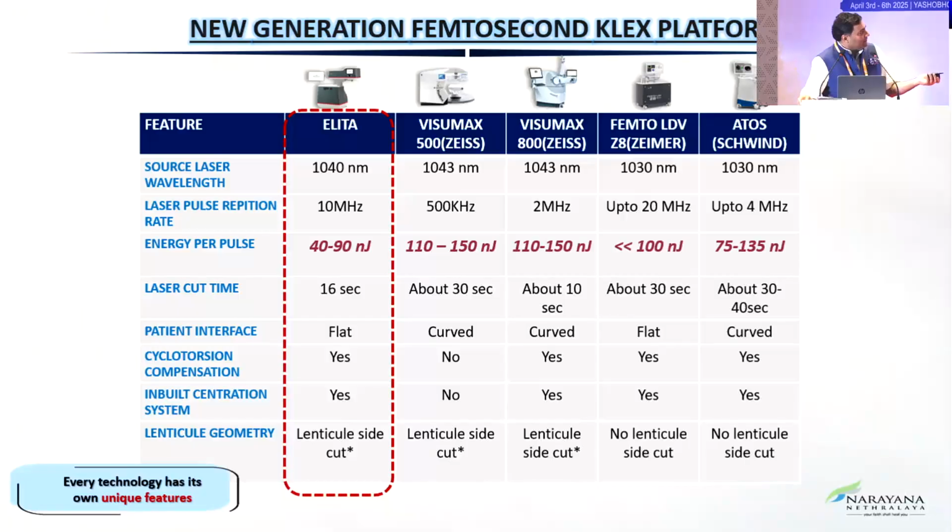When Vardhaman and I were using it, we had only one, the VisuMax 500, and nothing else. Every time we had a slide, we used to compare with, say, Contura or one of the other platforms. Now, with this coming in, it's very challenging for clinicians because we have to be very good with what we are doing and what we're using.